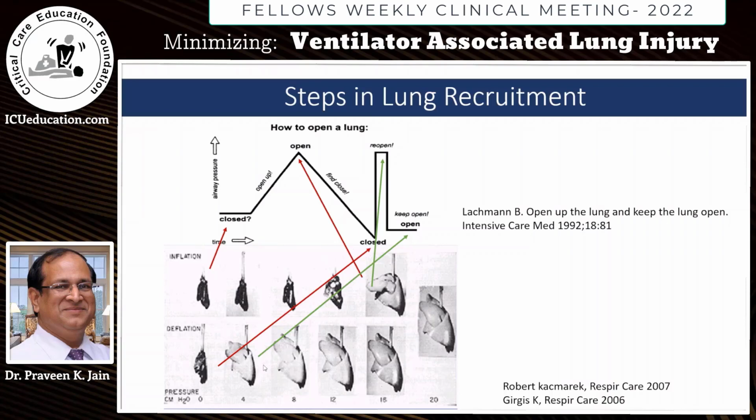With each picture, the incremental pressure increases by 4. So from 0 to 4, lungs are closed. 8, lungs are closed. 12, lungs are closed. At 16, the lungs open up. This becomes the opening pressure.